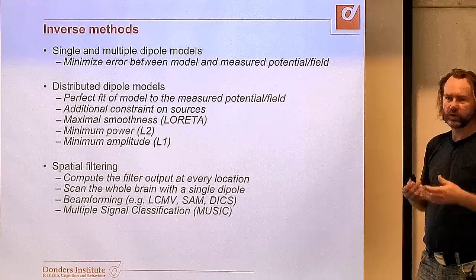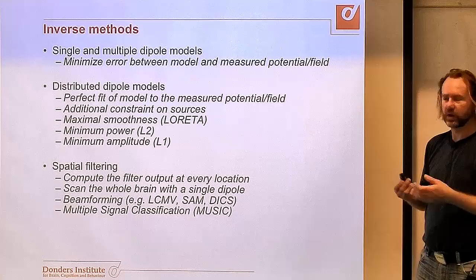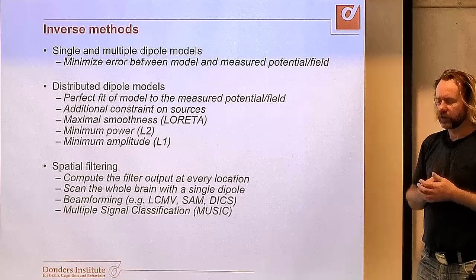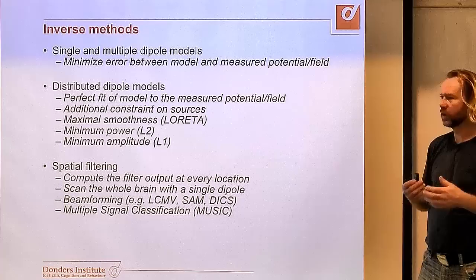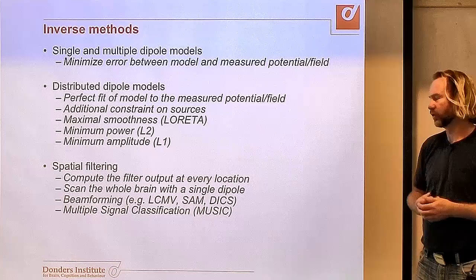That's the original beamformer as it was introduced in 1997 by Barry Van Veen in a really important paper. Later, modifications of this beamforming technique have been made using slightly different assumptions, such as synthetic aperture magnetometry and dynamic imaging of coherent sources.